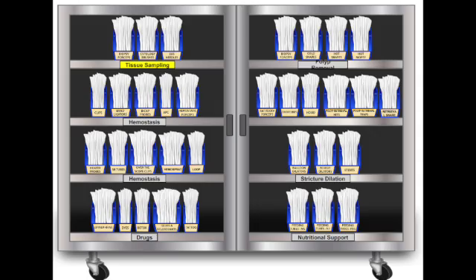Okay. Moving beyond TTS clips, there are bigger closure devices. Yes, the over-the-scope clip, or OTS clip. Think of it like a large bear trap deployed over the scope tip. Wow, what's it for? Bigger problems. Massive bleeding that TTS clips can't handle, closing larger perforations, treating fistulas, abnormal connections, like maybe a gastrostomy site that didn't heal properly, and also for anchoring stents sometimes. It provides much stronger closure. An even more robust closure.